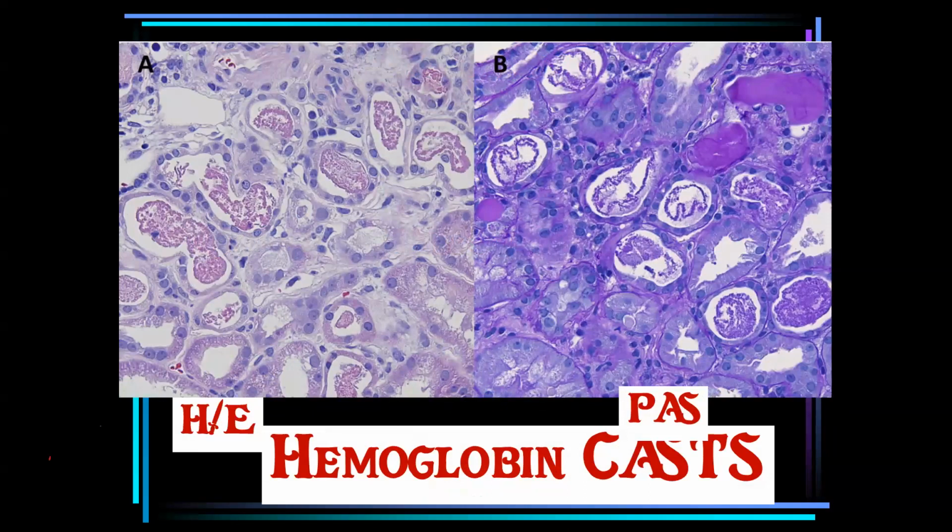This is the hemoglobin cast. If you look at it in the light microscope, this appears like a cast full of many granules inside it, as you see in this clinical scenario. So by light microscopy till now, whether in the hematoxylin and eosin or in the PAS stain, all of us can say there is a cast inside the lumen of the renal tubule. And probably it will help in the etiology of causing acute tubular injury or acute tubular necrosis.